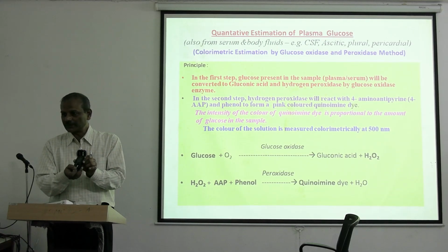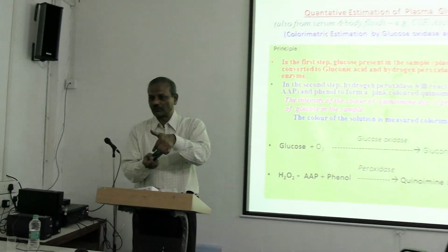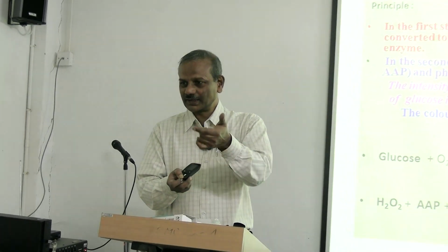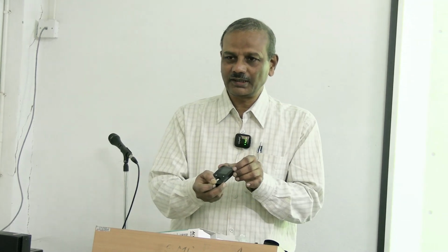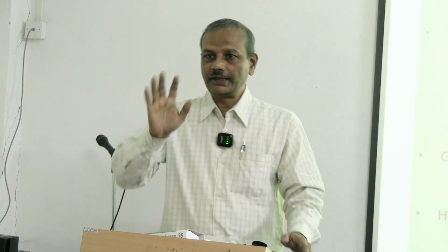So usually using a mathematical formula, the program is already calculated here. So although you are taking whole blood, the result which you are seeing is in the form of plasma. So it's plasma calibrated. So this literature you read. Wherever you go, wherever the machine is there, spend a little time to understand whether this machine has plasma calibration or whole blood, and accordingly you decide. And remember that a 10 to 15% variation is there. And one more, the technical part I will tell you later, because I don't want to confuse you with the main thing.